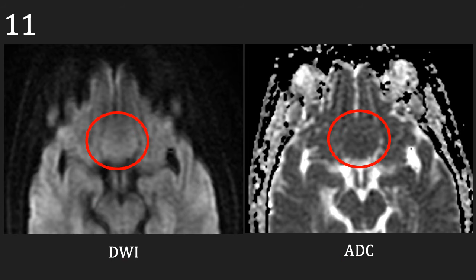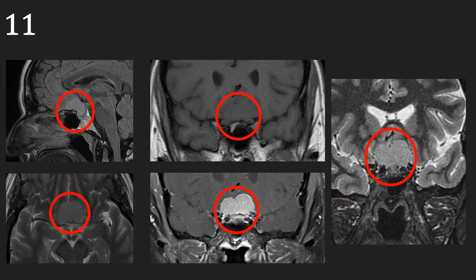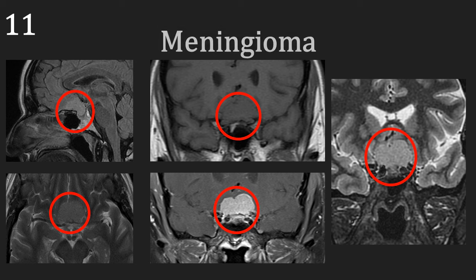There is relatively little signal abnormality on the DWI and ADC. The final two sequences are the pre- and post-contrast, where the mass lesion shows intense contrast enhancement. Bringing this all together, we have a mass lesion around the area of where the optic nerves lie, which is outside of the brain tissue and enhances with contrast. This is a meningioma that is compressing the left optic nerve, causing the patient's visual symptoms.